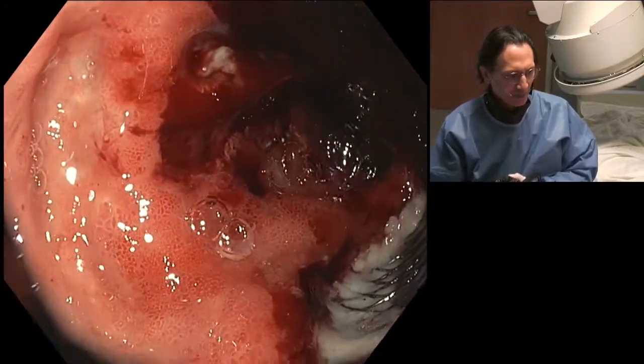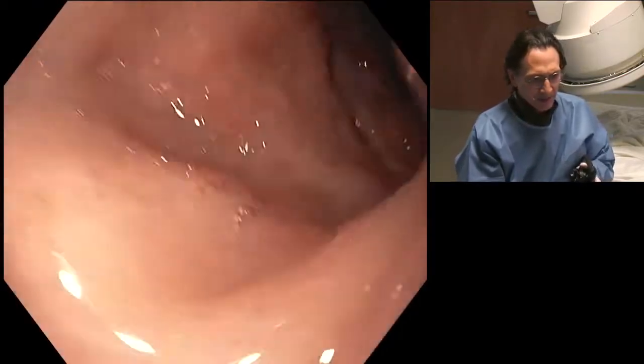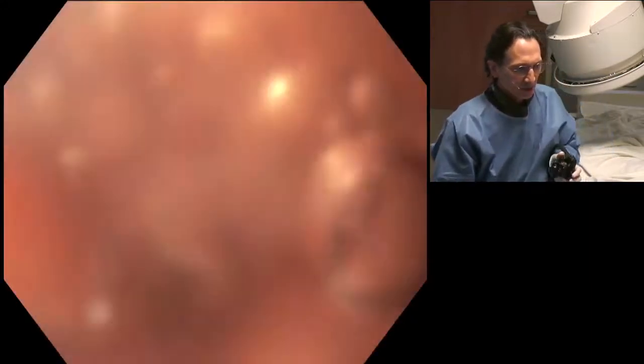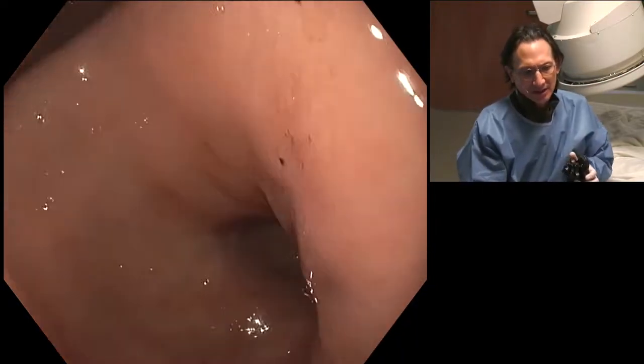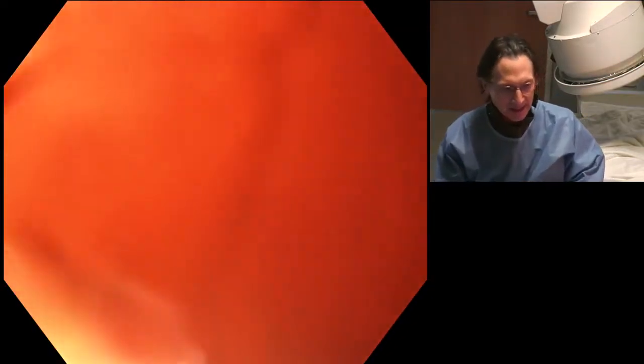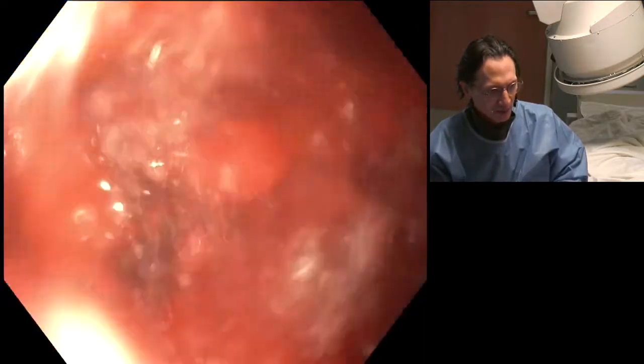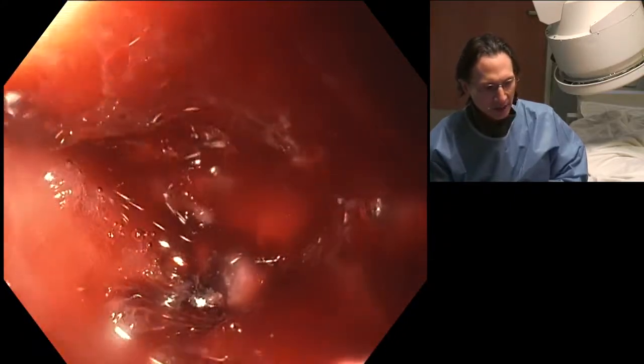If we pull back a little bit further, here we are in the proximal duodenum. Let's pop in one more time. Here's the antrum. This is the pylorus. You don't really see the pylorus well. Let me pull back just a little bit more. Yeah, so there's the pylorus, and it's patulous, it's wide open, and now we go into the bulb here, and we start to encounter pretty much at the apex already the obstruction. And there you can see tumor tissue, right? The whitish tissue here.